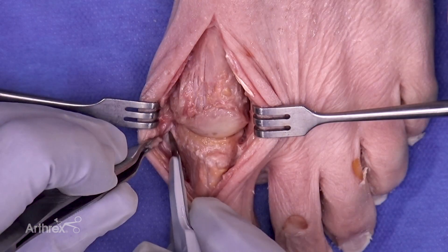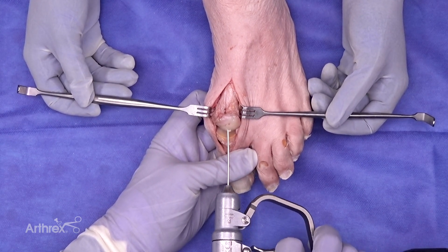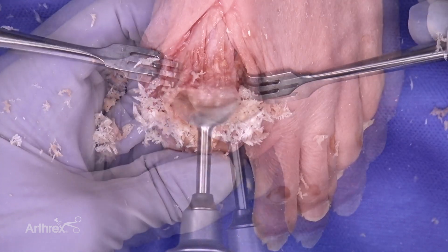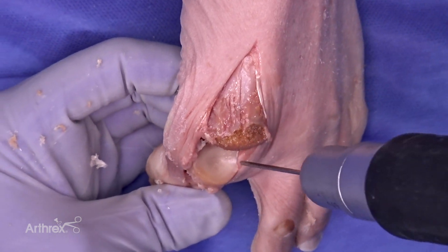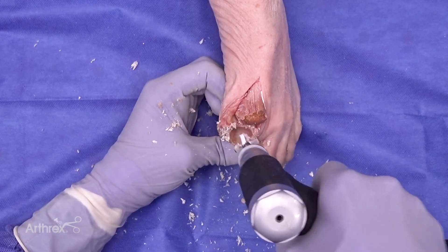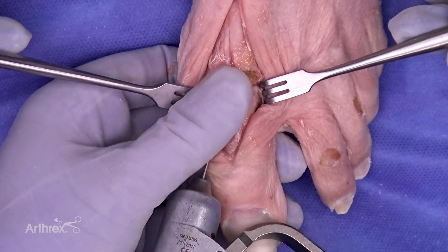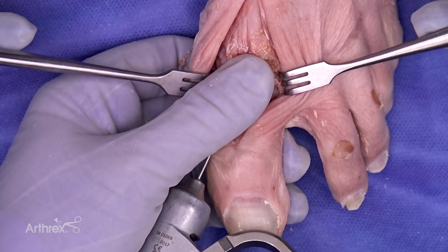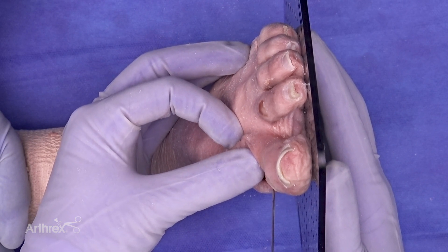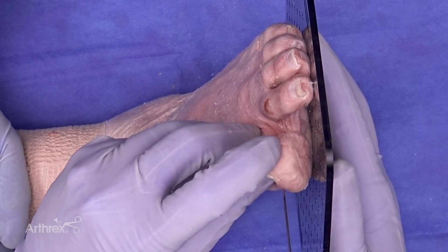We utilize a standard dorsal approach for first MTP fusion. Seen here is the center-center placement of the K-wire for reaming. You will prepare the joint in standard fashion. Critical to the technique is placement of the K-wire in the inferior portion of the joint — this allows you to obtain your extension degree. This pin will remain in place until fixation is complete with the MaxForce first MTP fusion plate. A lid is utilized to simulate the floor; extension through the IP joint allows the surgeon to obtain proper extension through the MTP joint for fusion.